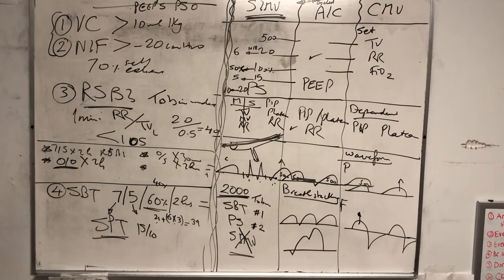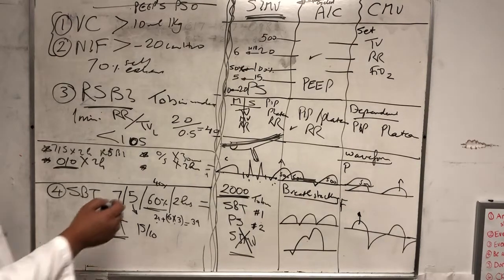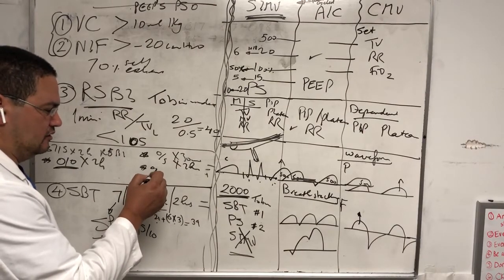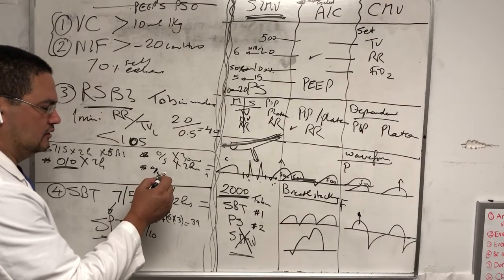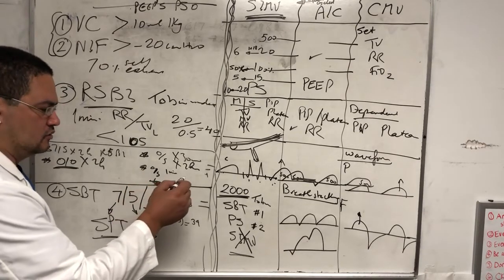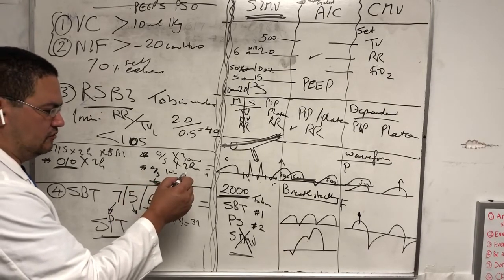All of those modifications, and the last modification, which really there is a study about it actually. I don't know why we would do that. They do an RSBI 0/5 in 1 minute, like the regular one. So it comes out like 40.